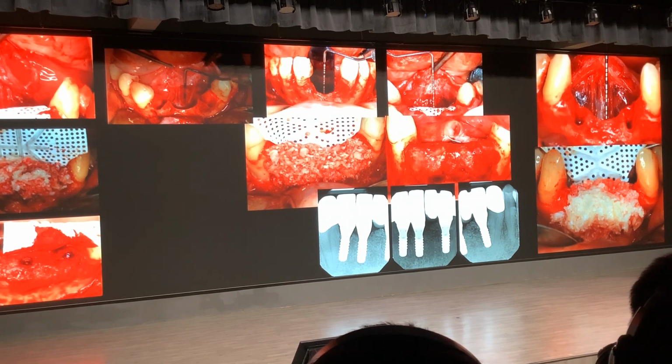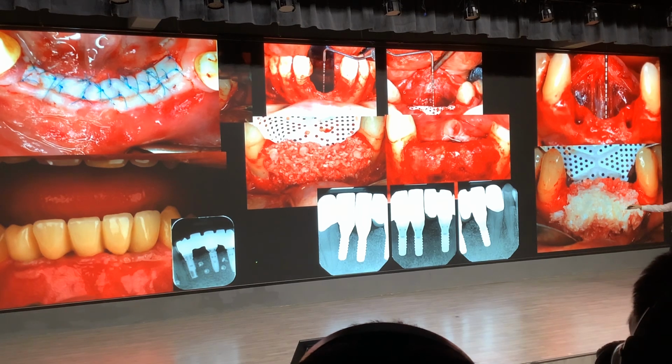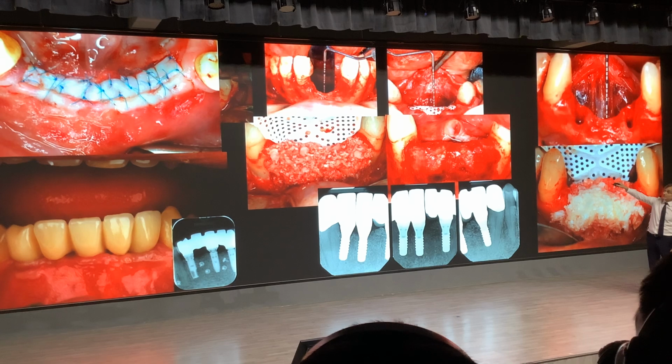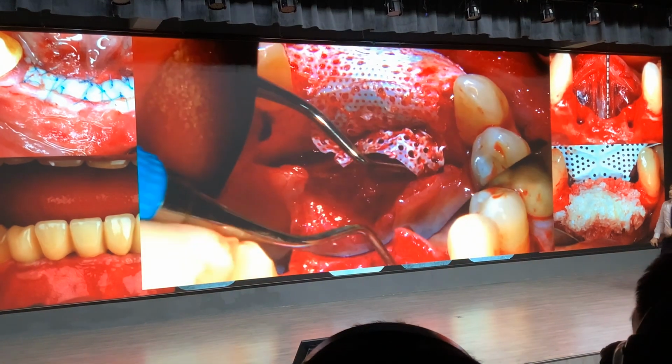Okay. This patient was sent to me from New York. They wanted this type of implant. I place that, but normally I place this one. I do a gingival graft on the lingual, on this one. But I want to show you this patient.